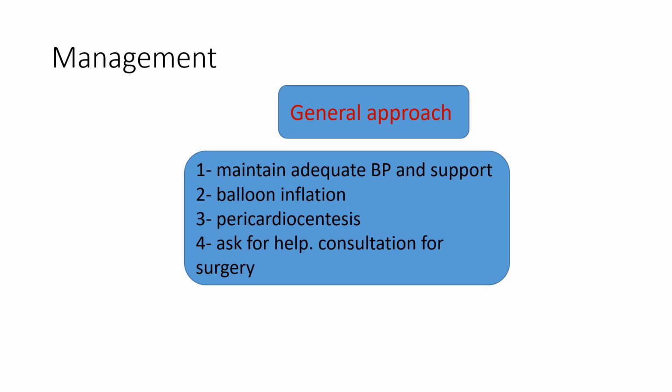So, what is the management in these cases? There are two major steps. First is the general approach. In that case, we have to maintain adequate blood pressure and support by giving intravenous fluid and probably blood, balloon inflation, pericardiocentesis when required, and it's important from the early beginning of the situation to ask for help from the surgeon.